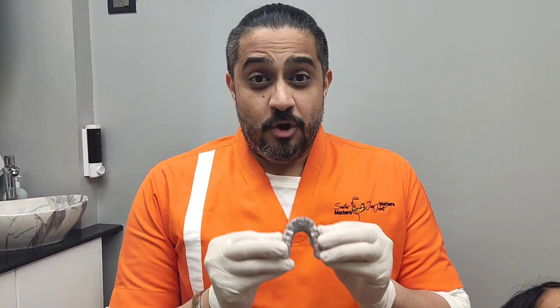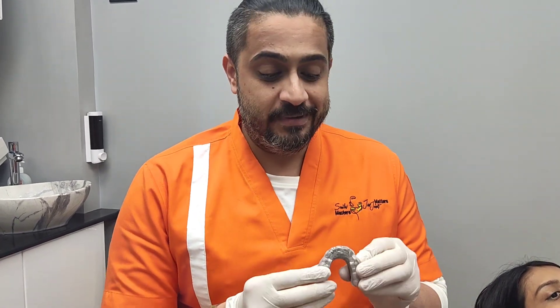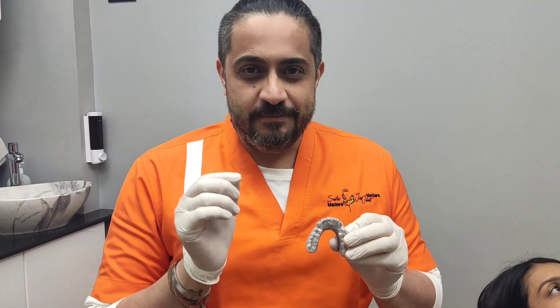CAD CAM splints are not just about aesthetics — they are also about form, function, and accuracy. These fit extremely precisely, they are very retentive, extremely stable, and they don't rock at all. And the best part is because they are milled, they are extremely precise.